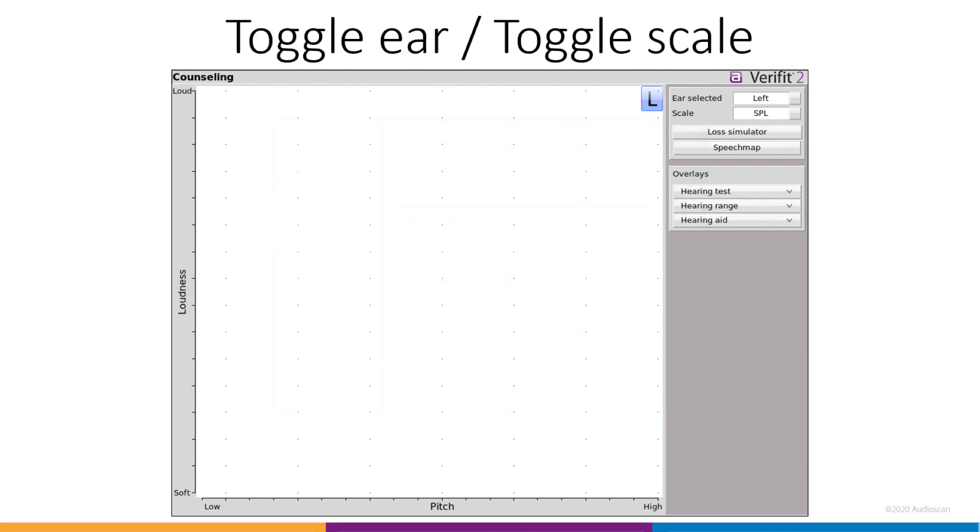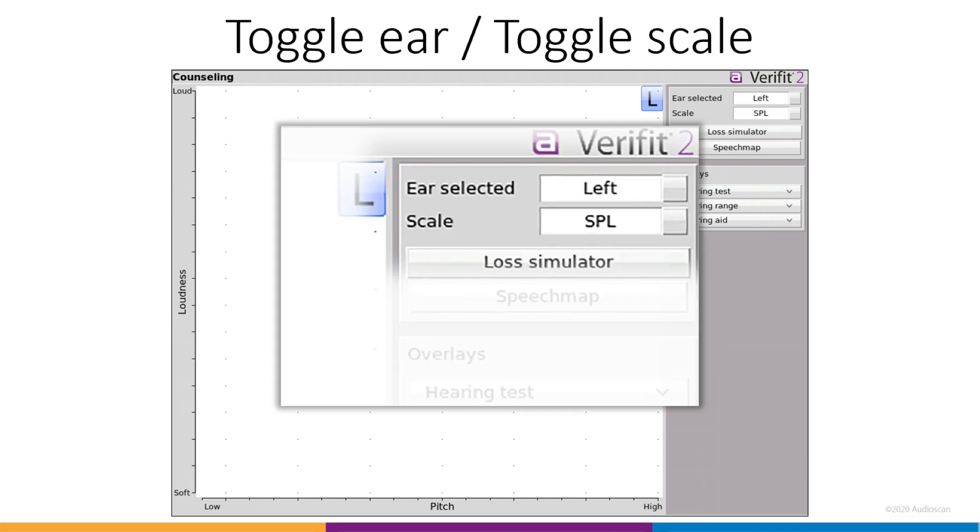In the upper right-hand corner, we have an ear toggle to switch between left and right ears, and a scale toggle which will switch between default SPL view and HL view. Note, HL view is only available in the first two overlay groups.